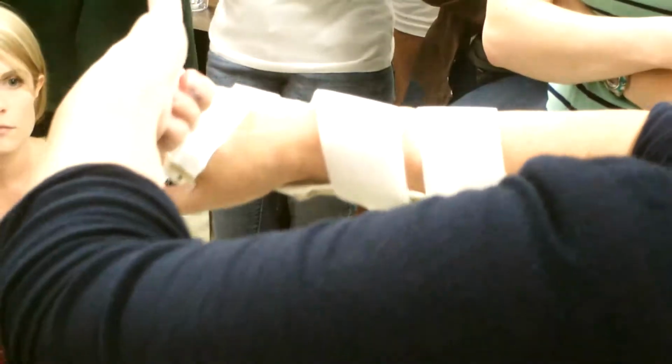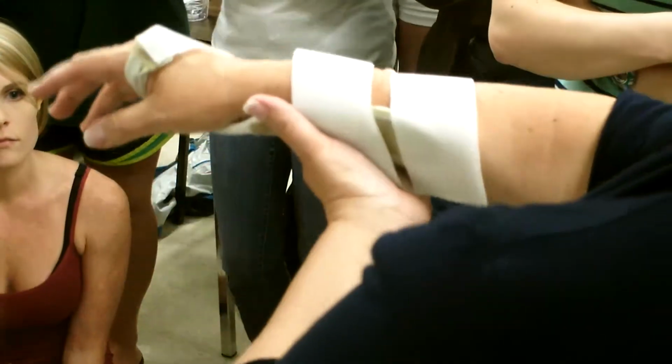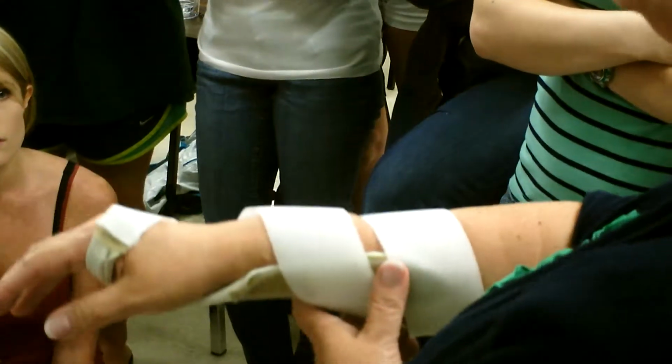You want to make sure here that, you know, it kind of, again, has that one finger under it. We give the patient instructions. Miss Rita, this is your finished product, your fake finished product.